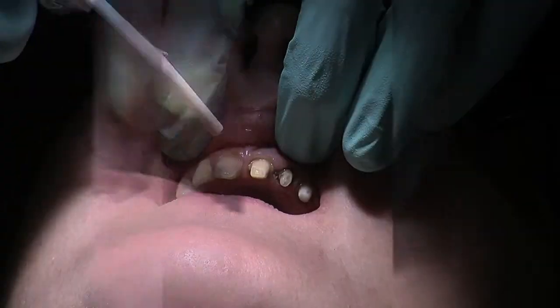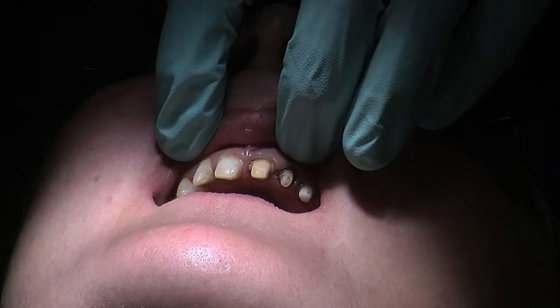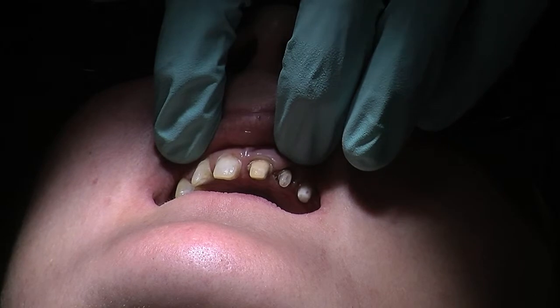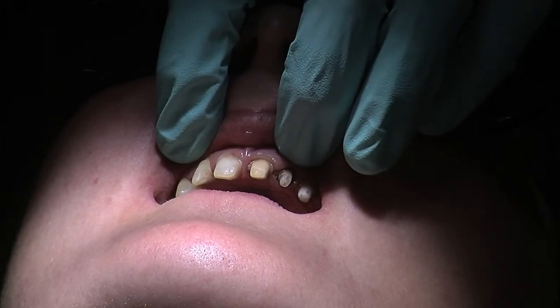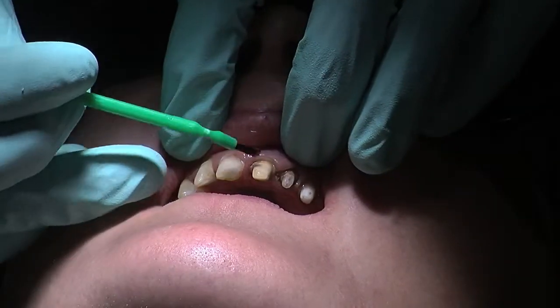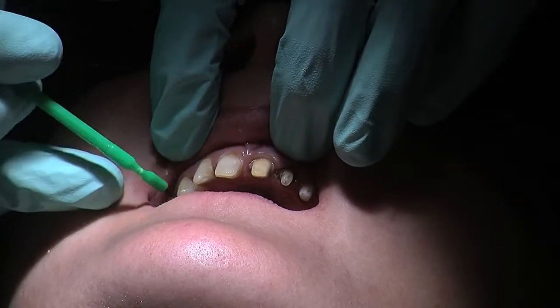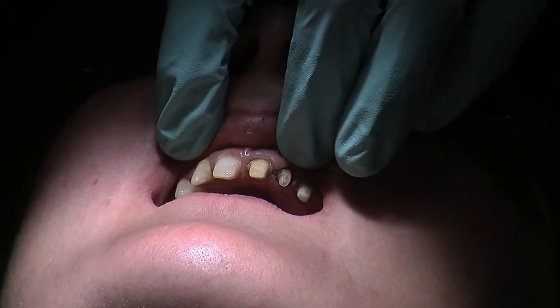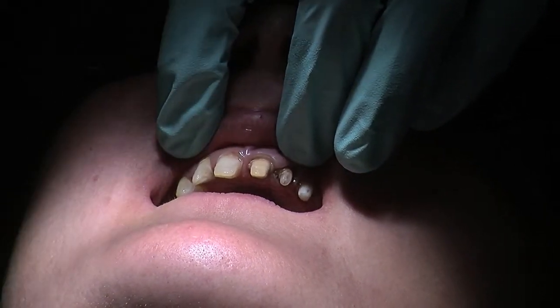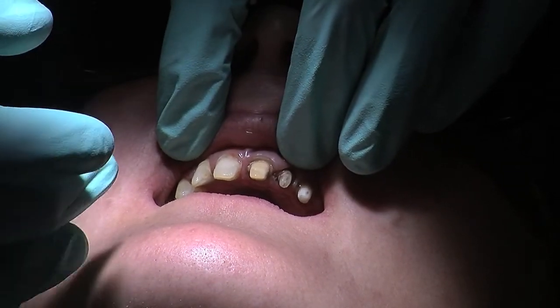like so. The next thing I'm going to use after this is Optibond FL2. This is the partially filled resin, so it's important to use only FL2 rather than Optibond Solo or any other bonding resin, because you don't want the temporaries to bond on too strongly. So just a very thin layer of the Optibond FL2 here at this point. I'm going to gently blow dry this as well. Leave that on for 10-15 seconds and then we're going to light cure for about 20 seconds each.